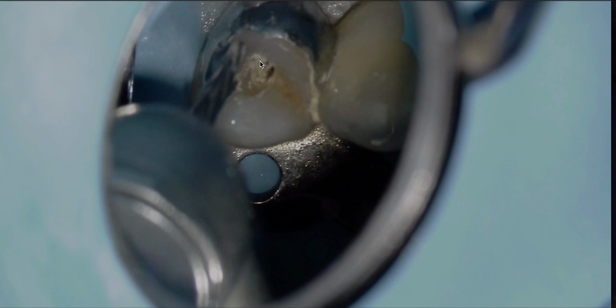So what I'm going to do now is I'm taking a long shank, slow round burr, and I'm just going to open that up, just to open up the axis cavity. So this is called a Muntz burr. But normally what I'll do, I wasn't happy with the way it was going, so I was like, I'm going to use my Endo Z burr, so it's a high-speed burr, non-cutting tip, just to open it up a little more buccal lingually.